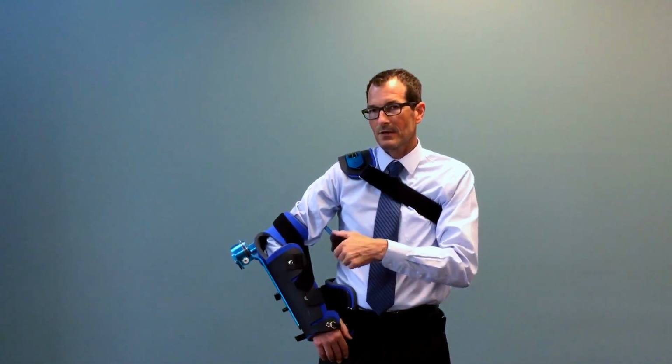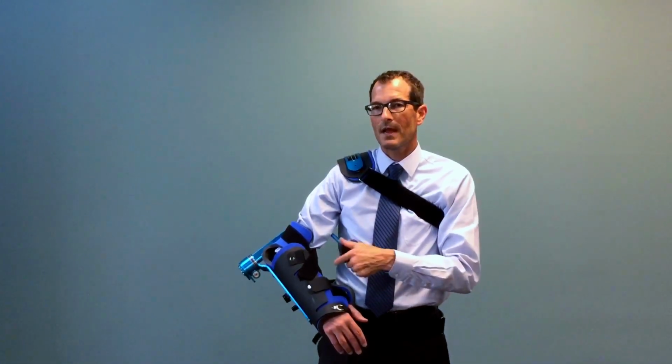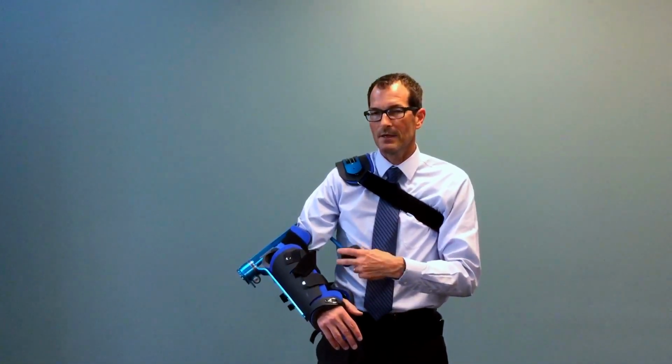Shift back into external internal rotation, and once again, the primary motion that the patient will utilize in order to regain shoulder flexion is going to be external rotation.